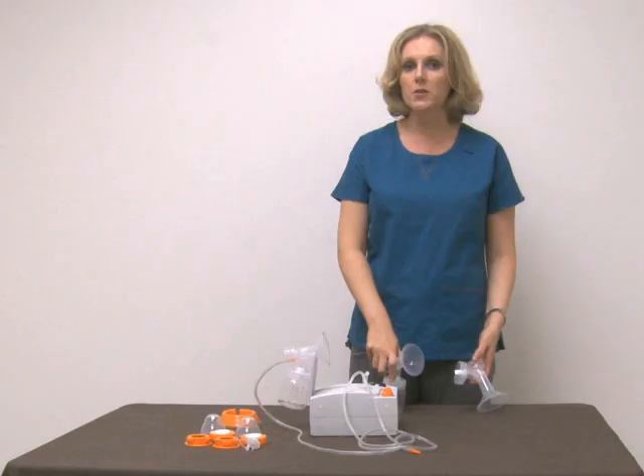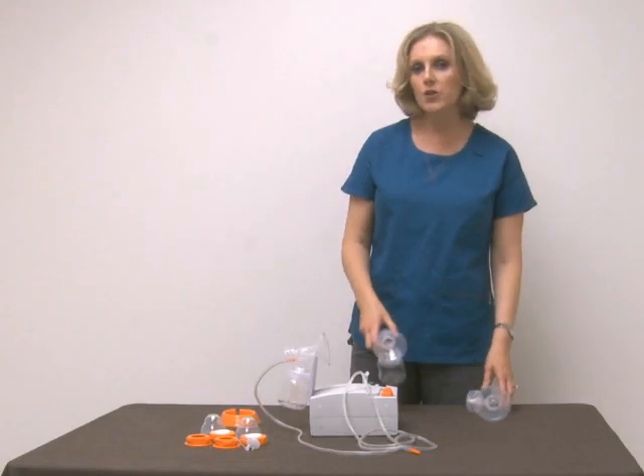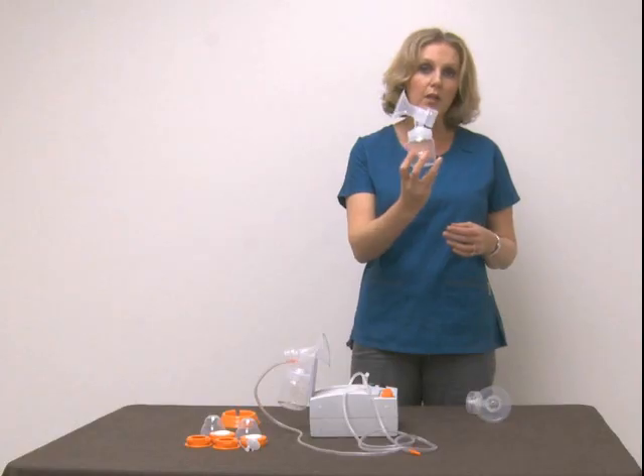Today I'm going to talk about one of the most commonly asked questions: flange size. When you get your personal accessory kit with your Hygieia pump, it's going to come with a standard medium flange size.